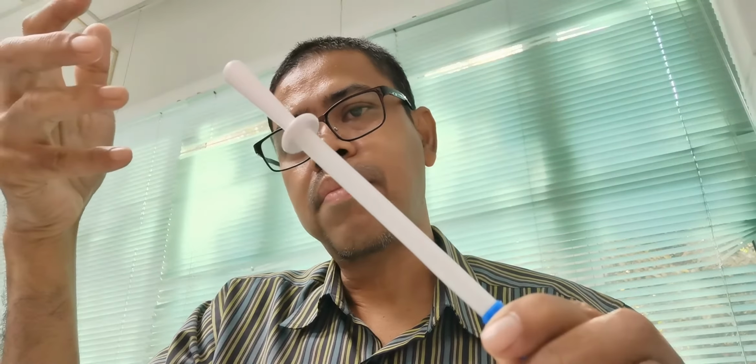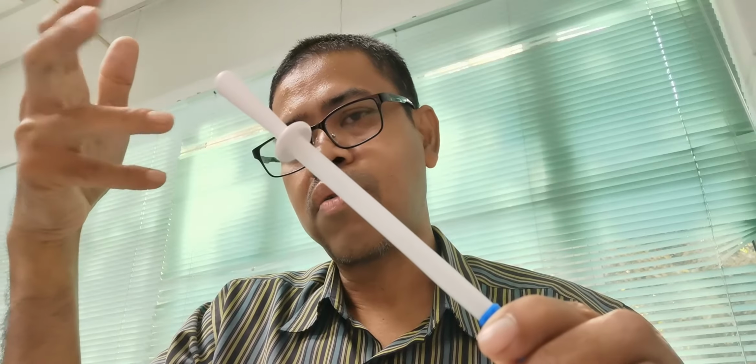Suprapubic catheterization. There are many products nowadays. You can have the normal suprapubic catheter size 12 where you have a sheath outside and trocar from inside, or you can have this plastic Cystofix size 16, where the mode of introduction is almost the same.